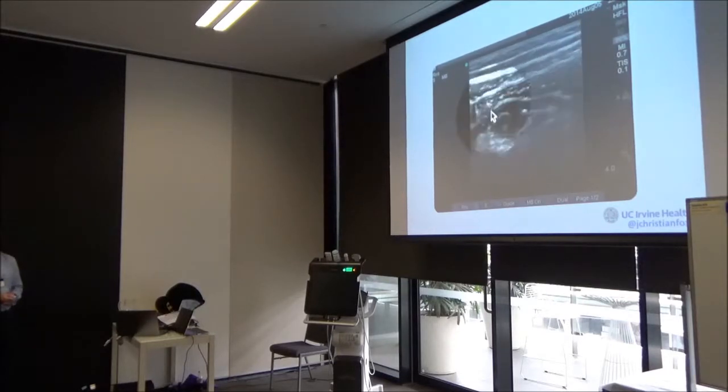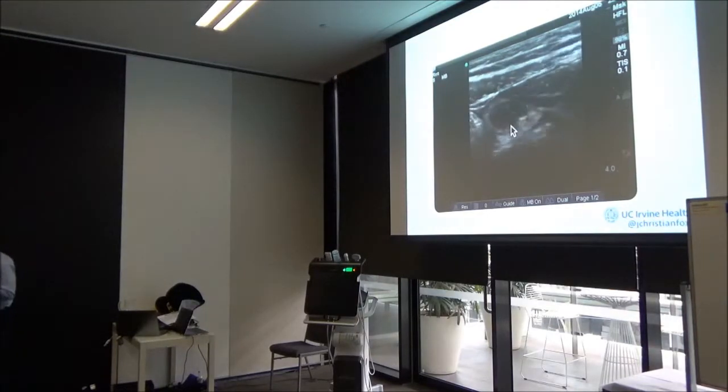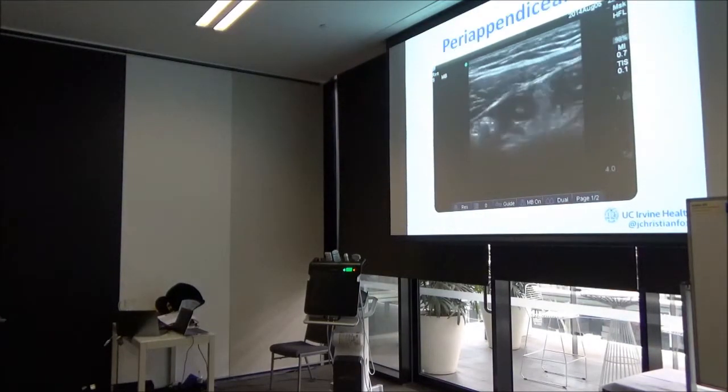With a nice submucosal layer. So in this case, yeah, it's acute appendicitis, good submucosal layer. Depending on the situation, may end up getting IV antibiotics, depending on my surgeon, my institution, all those things.